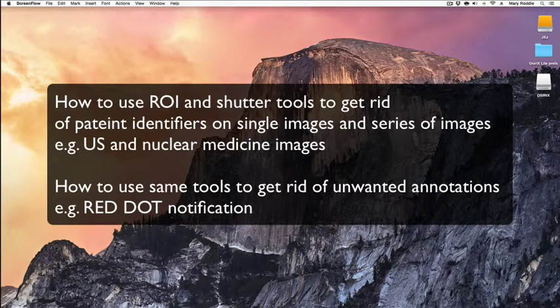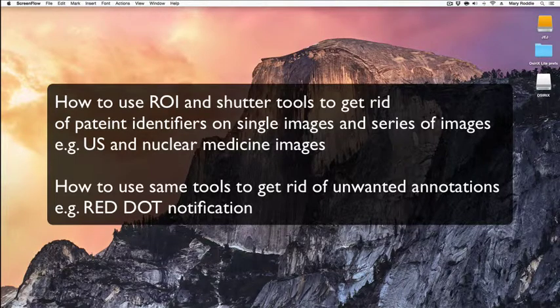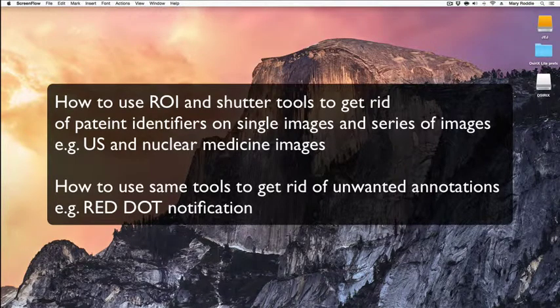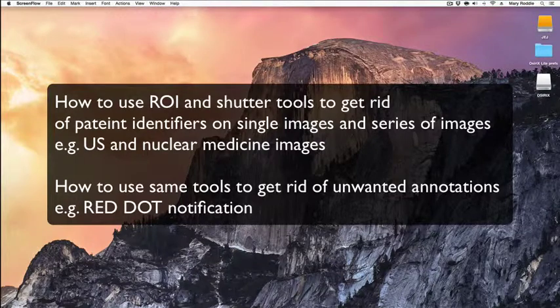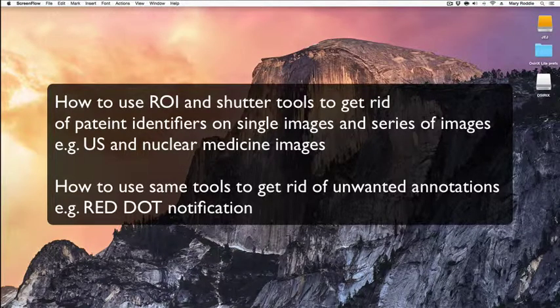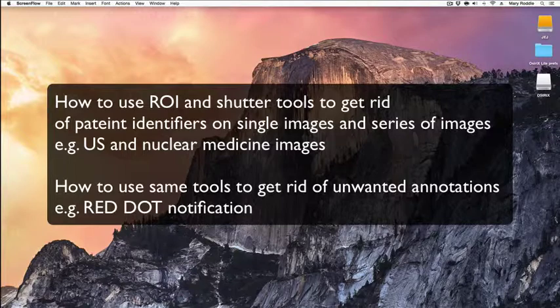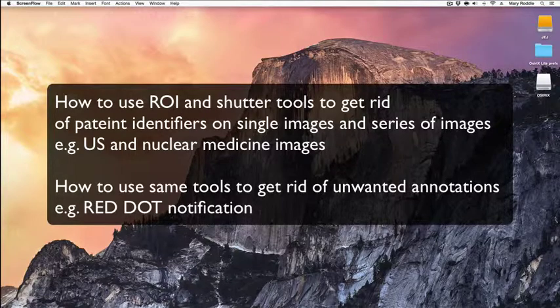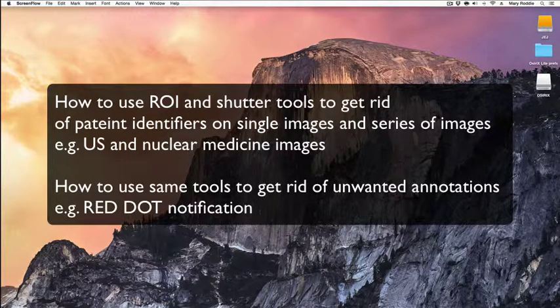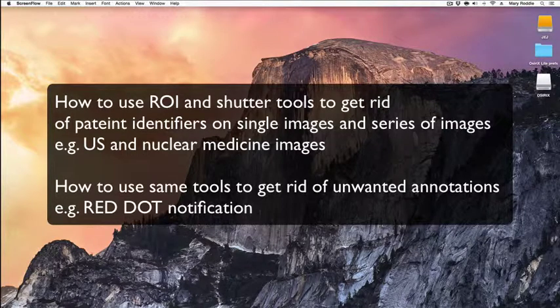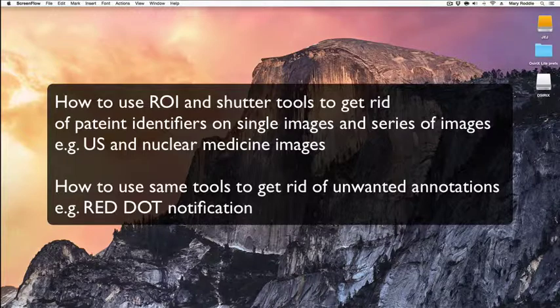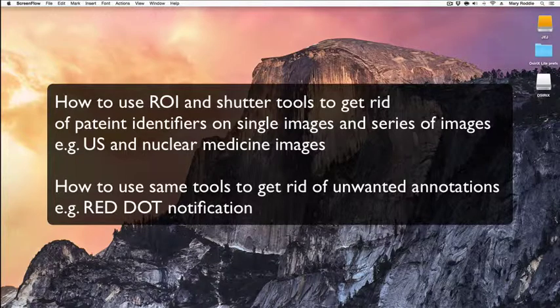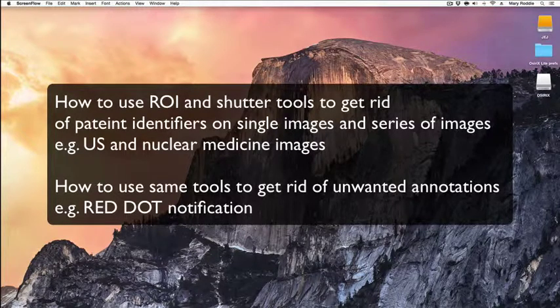So to summarize, we have covered how to use the region of interest and shutter tools to get rid of patient identifiers from single or multiple ultrasound images and also how to get rid of single areas of unwanted text on radiographic images to make them more suitable for teaching. I hope you found that useful. Thank you very much.